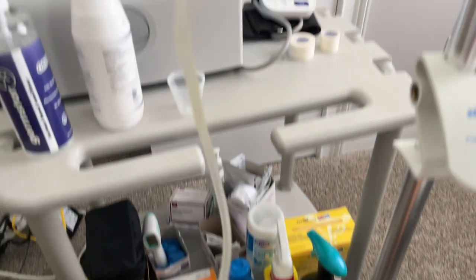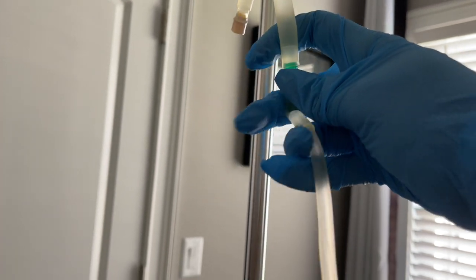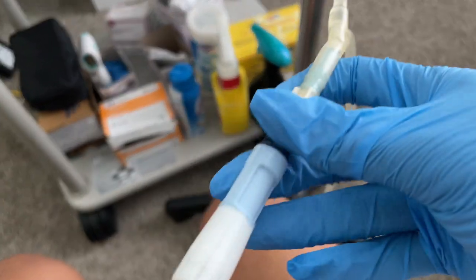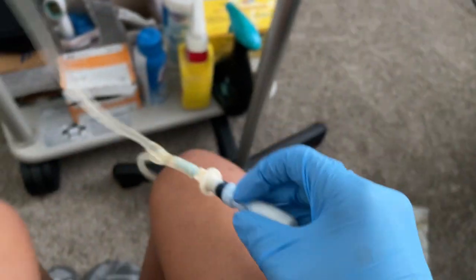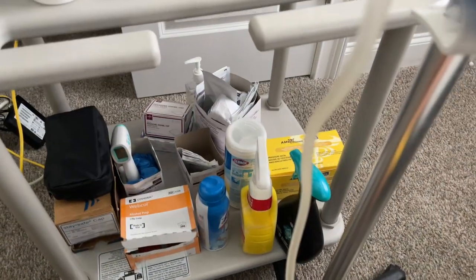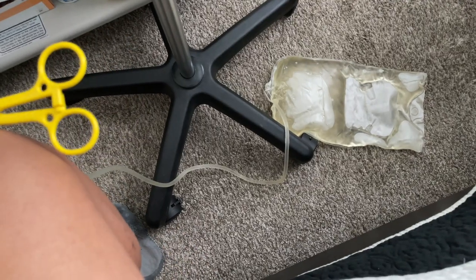Now it's time to start the fill phase, which you do by breaking the green seal. I highly suggest that as you are cracking the green seal you keep your catheter port closed — that way any air bubbles in the tube drain to the drain bag before they enter you, which will cause extreme gas pain that is very difficult to get rid of. This dialysis clamp that my clinic provided will prevent the dialysis fluid from bypassing my abdomen and draining directly into the drain bag.